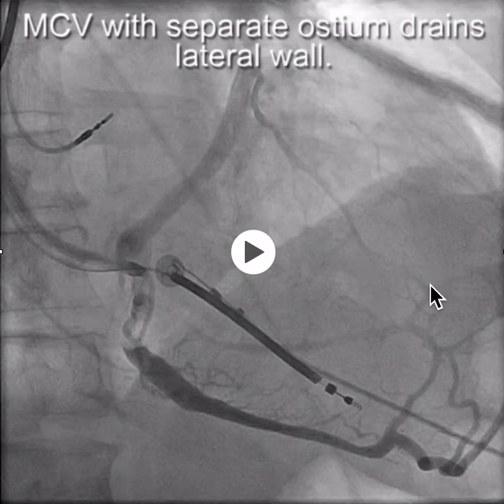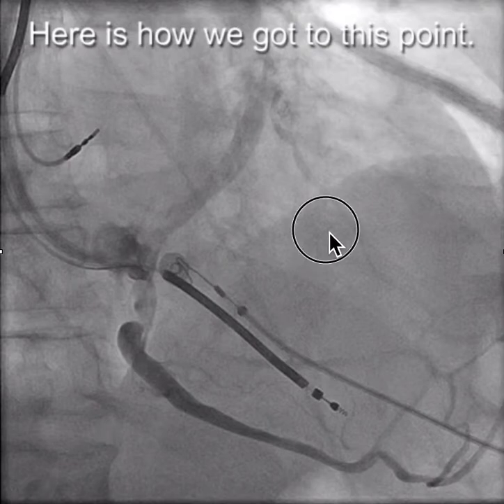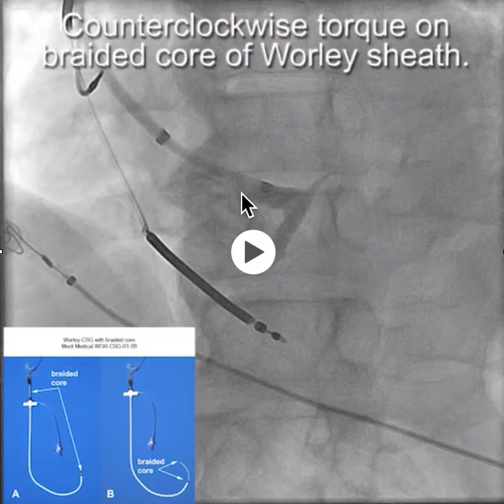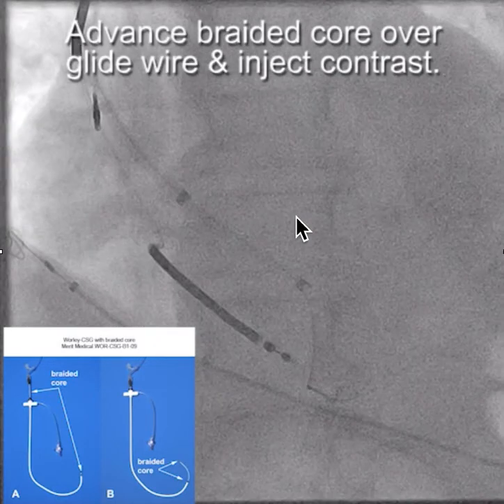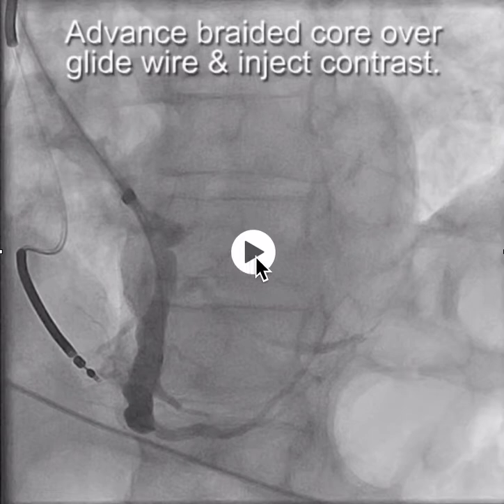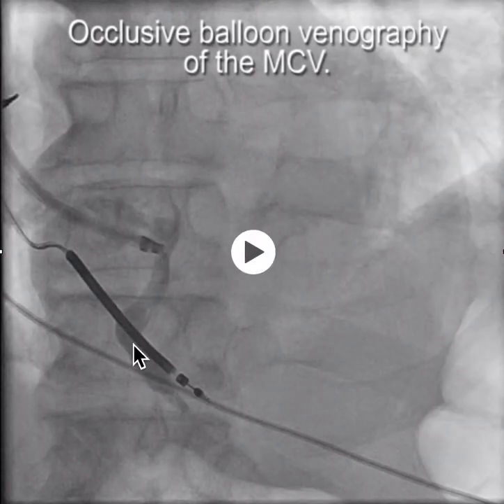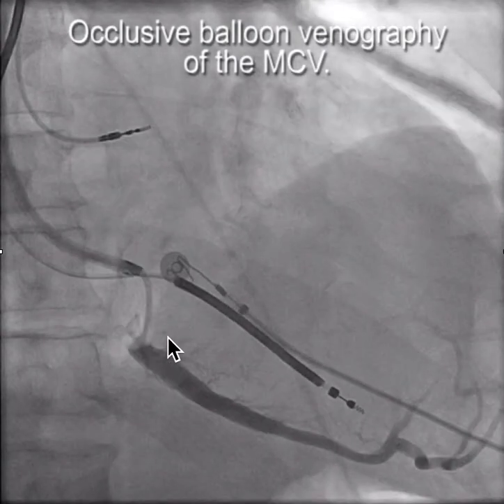This is a case we did recently, primarily done by the fellow, of a patient with a separate ostium of the middle cardiac vein in the coronary sinus. You can see here we're doing the balloon venogram. We started off applying counterclockwise torque to the braided core of the sheath and engaged this structure. With contrast, we advanced the glide wire down and saw that we were in this large middle cardiac vein, and you can start to see that there are branches going to the lateral wall. We put in a balloon and we're doing an occlusive balloon venography, and now we see where the true CS is up there.